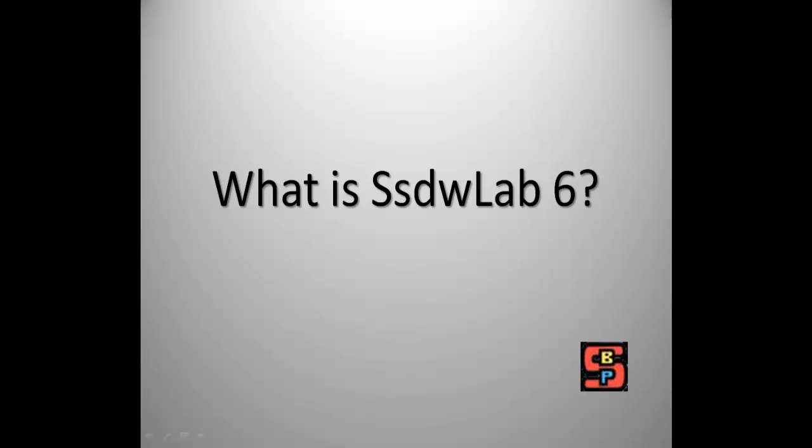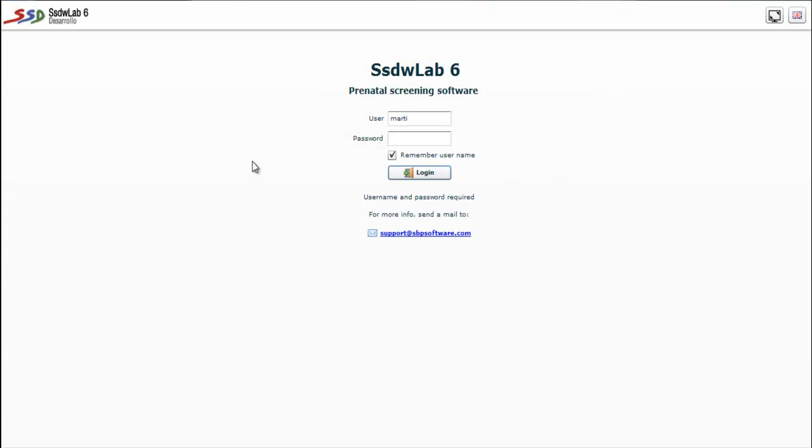What is SsdwLab6? It is a web application accessible from any web browser, especially directed to multi-center installations with large numbers of patients, dedicated to screening for aneuploidy and more specifically T21, 18/13 and neural tube defects and preeclampsia.